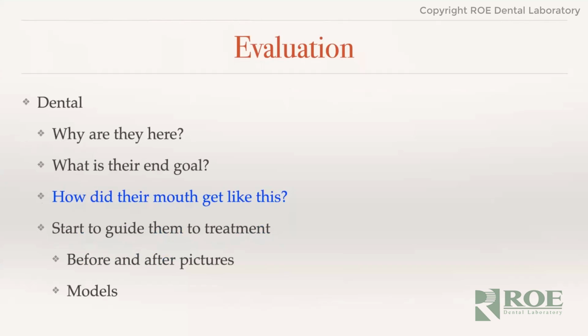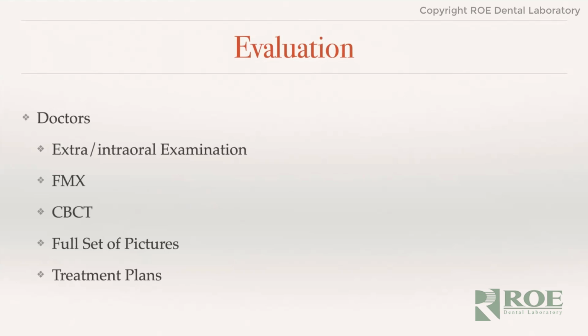And then it's really up to the treatment coordinator to start to sell the case for us, with before and after pictures, getting the models going of what the jaw looks like when it loses teeth, and this is what we do to start making sure that everything happens in the right way. Obviously, with the doctors, it's our responsibility to do all of these things: extraoral and intraoral examinations, FMX, CT. I'm not going to go into a full explanation of all this. You know about this, and that's for another lecture.